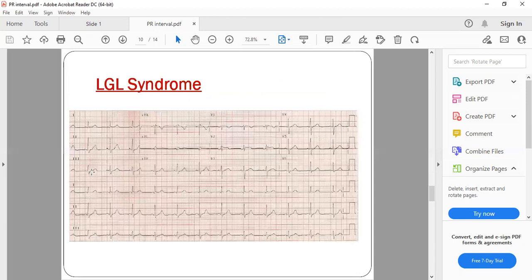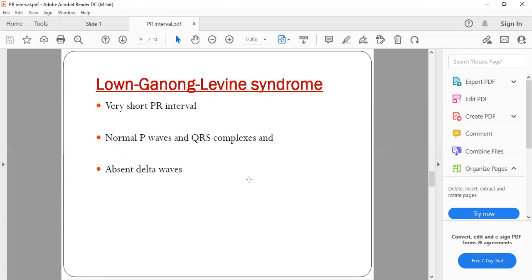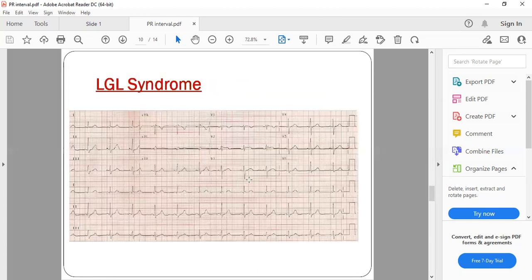In the ECG for LGL syndrome, you can see the P wave is present, there are only two to three small squares for the PR interval, the P wave is normal, and the QRS is also not broad. WPW is expected to have a broad QRS, but in LGL it is not broad, and there is no delta wave. This is called LGL, that is Lown-Ganong-Levine syndrome.